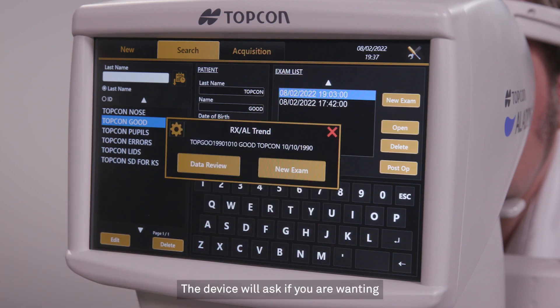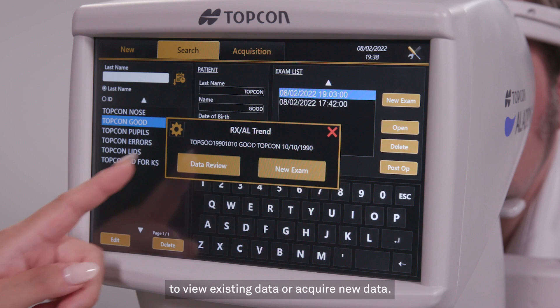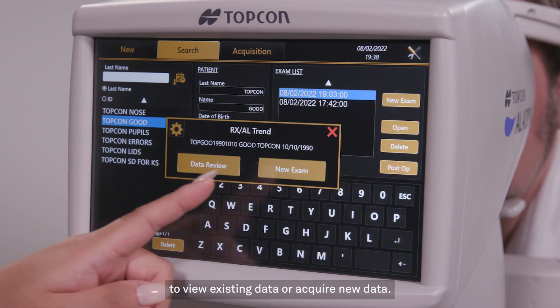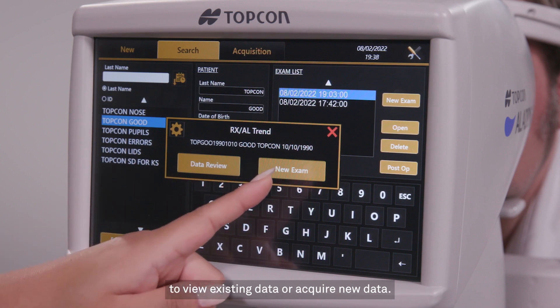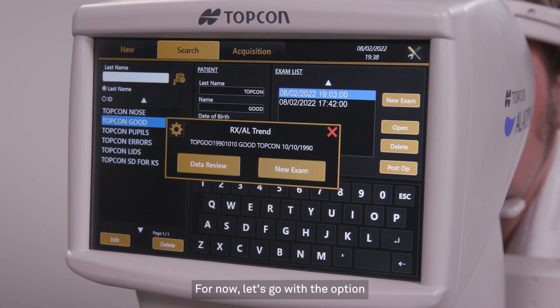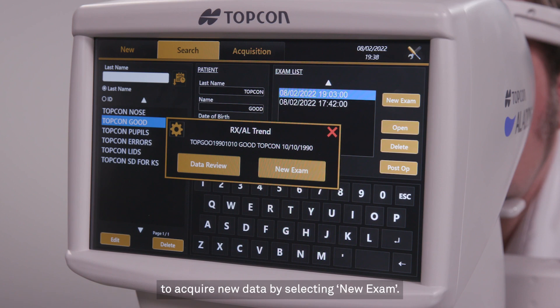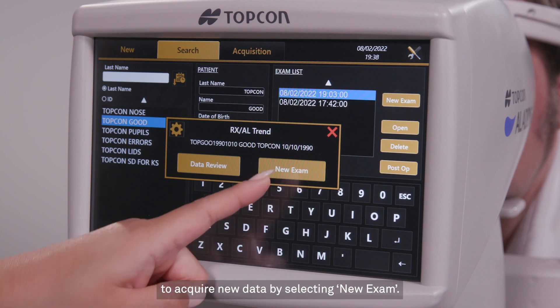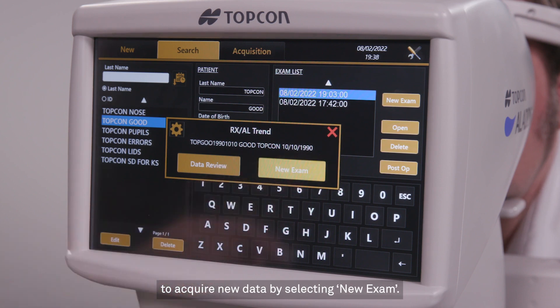The device will ask if you are wanting to view existing data or acquire new data. For now, let's go with the option to acquire new data by selecting new exam.